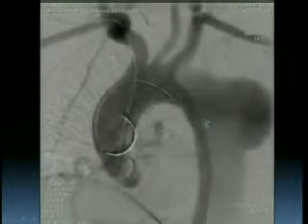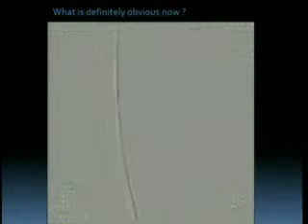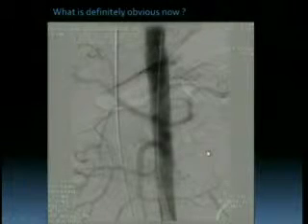So we decided to seal the entry tear, which is located somewhere there, which I don't think is a very difficult thing to do, but yes, it's important to access the true lumen correctly and put your graft into the true lumen by sealing the entry point. So we did that, and this is the stent graft, where we are covering the left subclavian here. This is something all of us have done many times, and for people who do endovascular stent grafting, this is not a big thing.